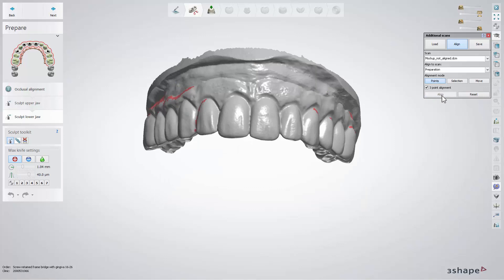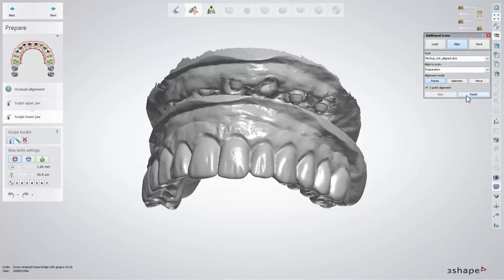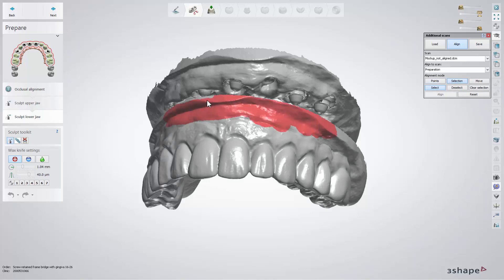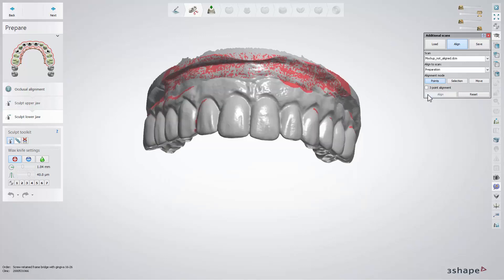You can also align by selecting a specific area on the screen, by clicking the selection button and then selecting the area on a scan and putting in the points. Then the scans will be aligned using the selected area functionality.